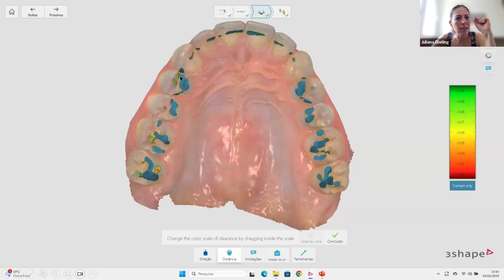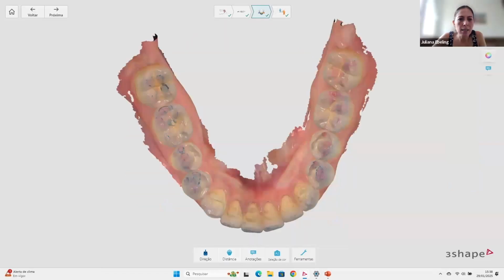So when I analyze OccluSense data, I will expect that these contacts will happen in green, okay, because the surfaces are very large, and these contacts will happen at the end of the movement, because at the end of the movement, it's the maximum force, the maximum muscle contraction, and then they will reach this contact. Okay, does it make sense? Yes. Yes. And here it's the same.